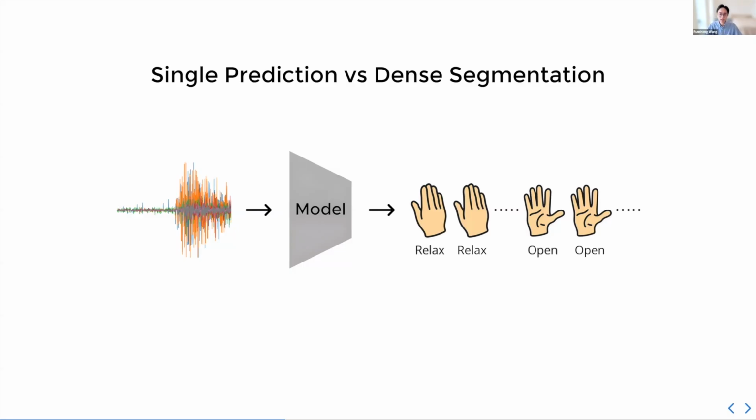So if you think about the example on the left here, the same open label is applied to the start of the gesture, the onset of the gesture, right? The middle of the gesture, and also the steady state sustained gesture, right? And these are very different distributions. So we really need to contextualize this and ground the EMG features in the underlying intent.